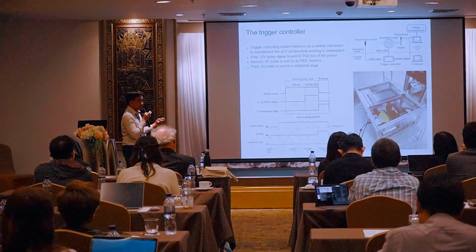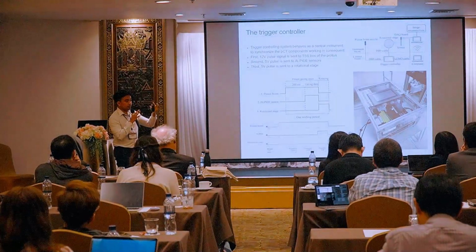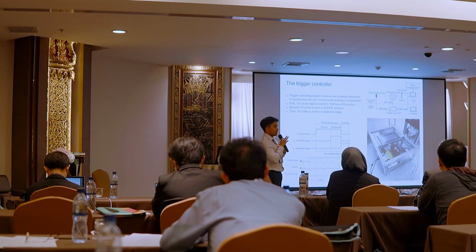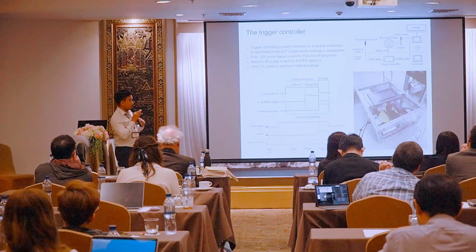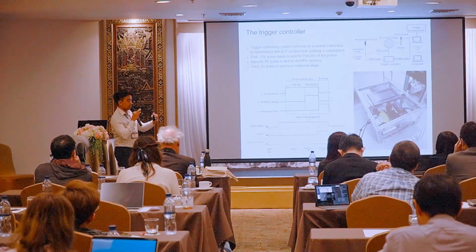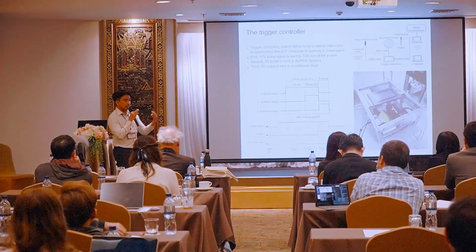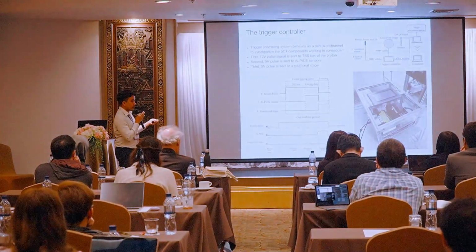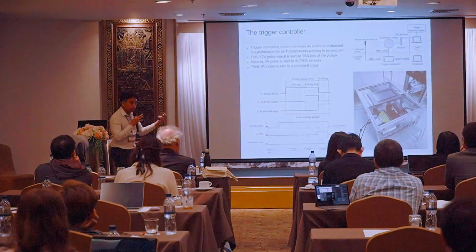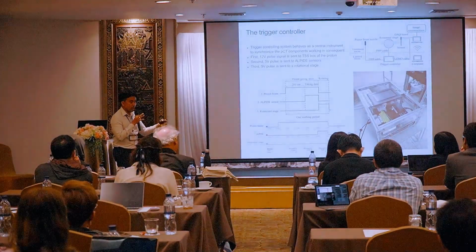Actually, this one takes advantage of a system at KCMH. There is an additional trigger system to measure the height of the body for the movement of cancer. If you're breathing in and the height of your body is higher, then it stops shooting protons, and then when it lowers, they can shoot the proton again. We took advantage of this and produced our own electronic device that can really turn on and turn off the proton beam at our desired time.